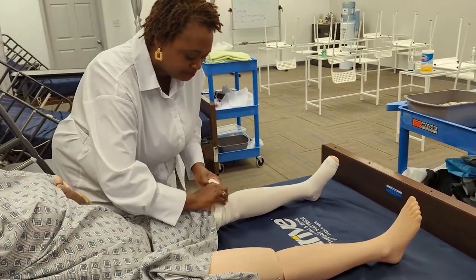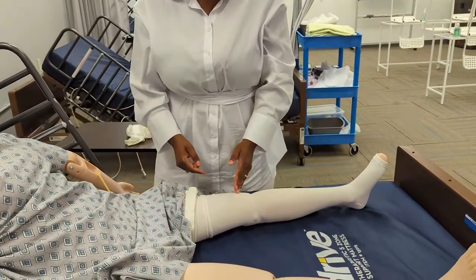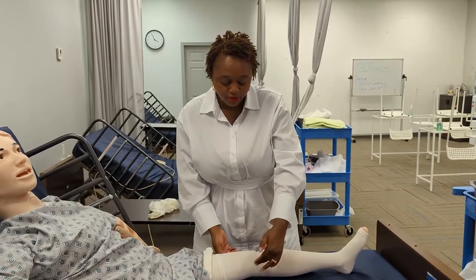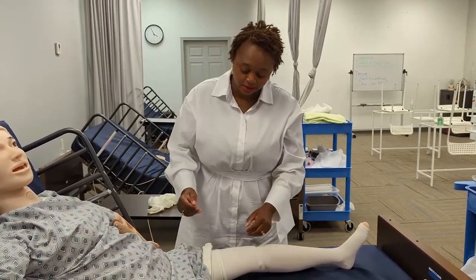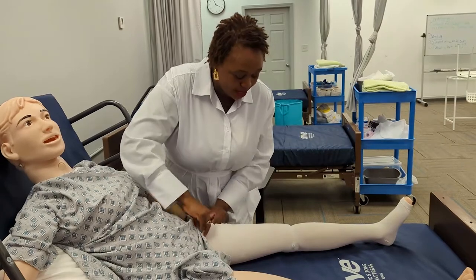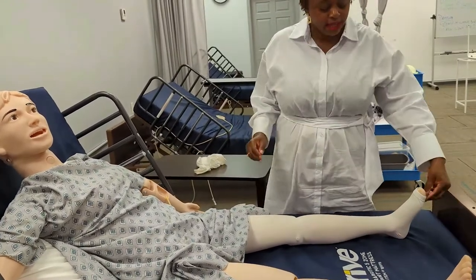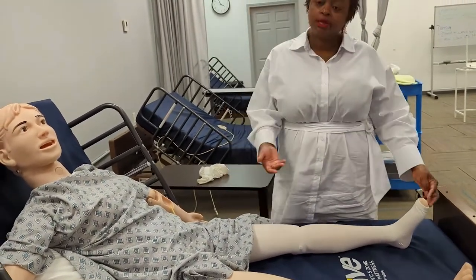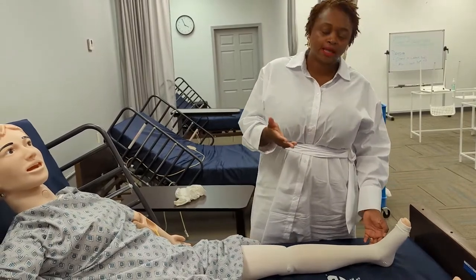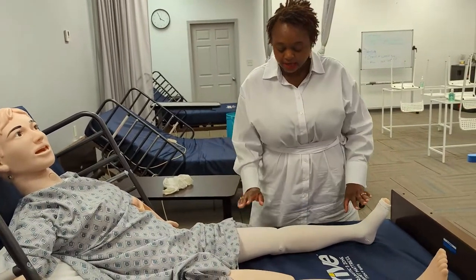These are thigh highs, so they go up a little higher. Knee length would stop a little bit above the knee. With knee highs, be careful because the knee bends and people move around, so they can curl up behind the knee sometimes. Thigh highs go all the way up. I do one last check to make sure it's smooth. The toes are exposed — ask the patient to wiggle their toes. You can also check pulses at the posterior tibial, behind the ankle bone, and make sure there are no wrinkles, creases, or tourniquet formation.